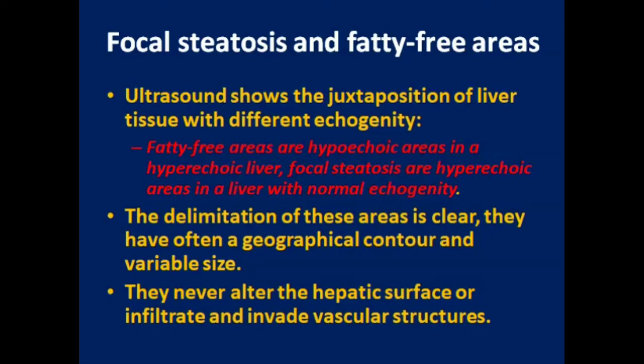The delimitation of these areas is clear. They often have a geographical contour and variable size. They never alter the hepatic surface or infiltrate and invade vascular structures.